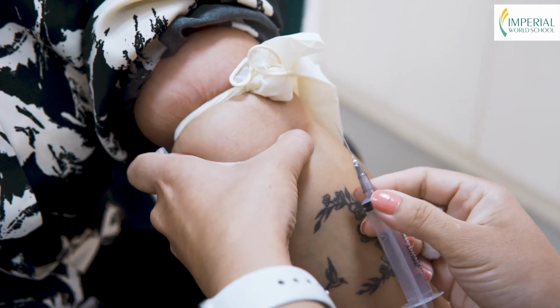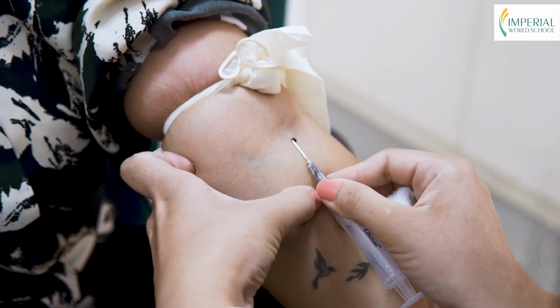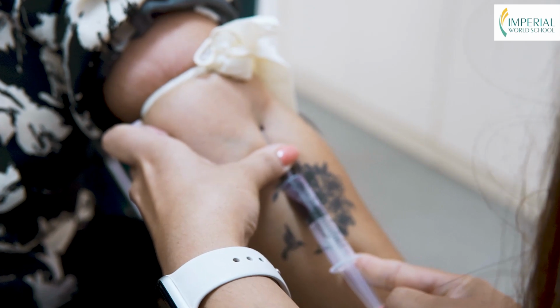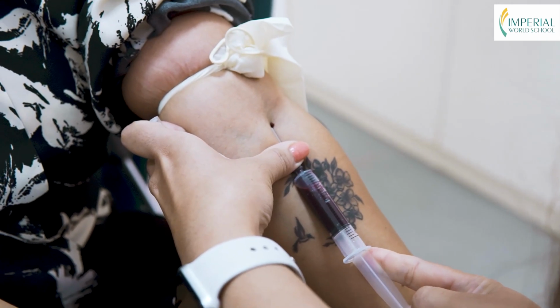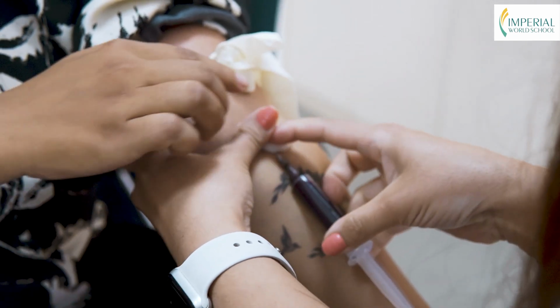Today we are going to separate these two main components and show them to you. Now we are going to draw blood and we have our teachers here for assistance. Now we're going to centrifuge this blood sample.